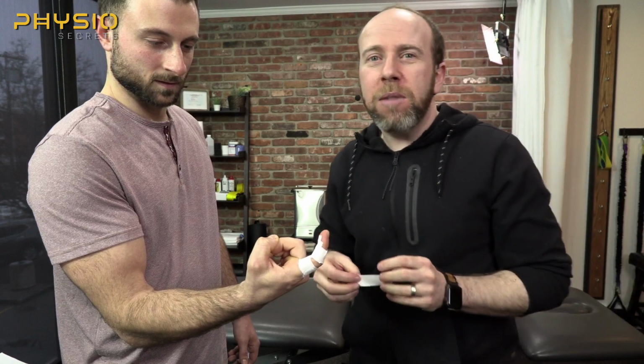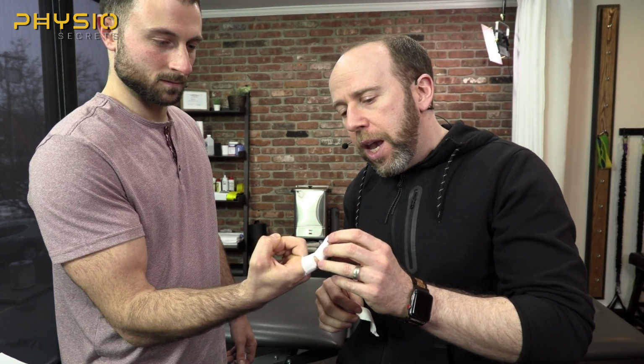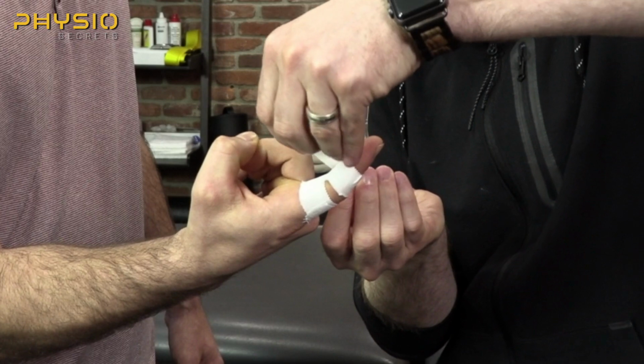Now I'm going to test the amount of tension that I have. So slowly try to extend your finger. And we'll see the tape goes on tension there. So that's exactly the position that I want that tape to go on tension. I'm just trying to block end range motion.